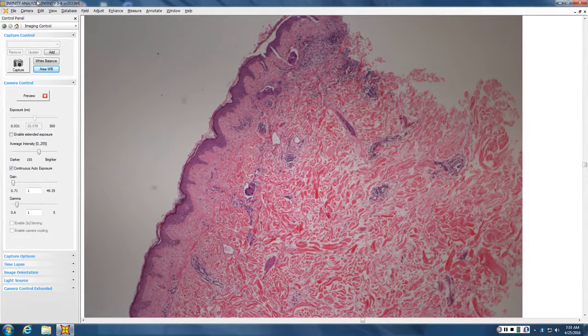Yeah. You think they're just there within lymphatics. Within lymphatics. So I was going to say squamous cell, but I don't know if you're leading me somewhere else. Could be squamous. I do see some little intracytoplasmic lumen formation here.